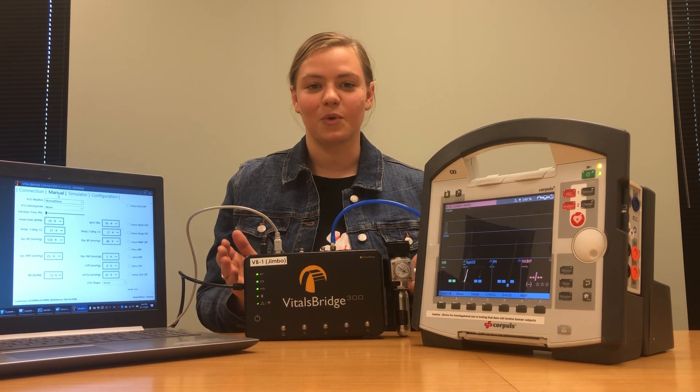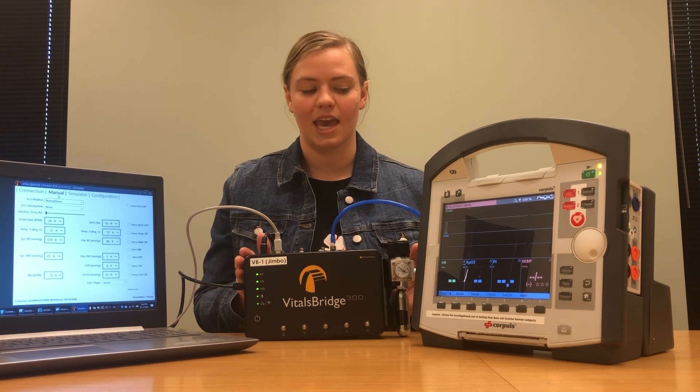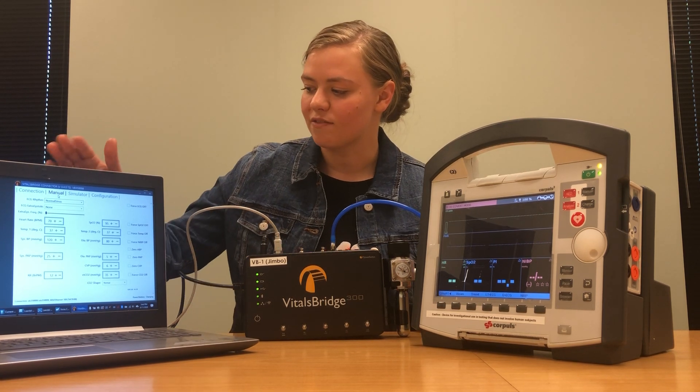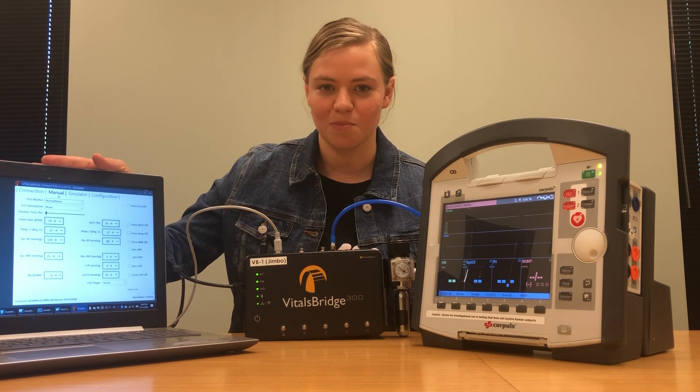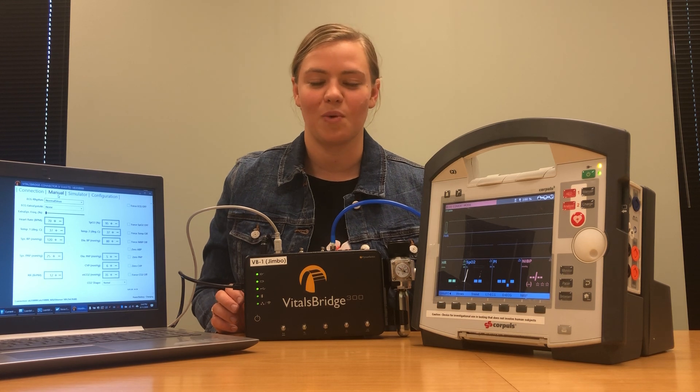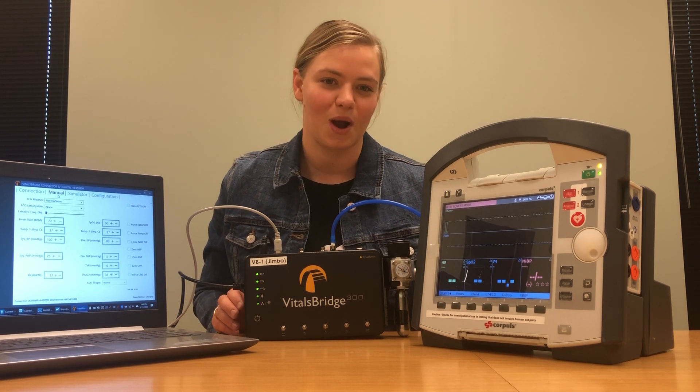Throughout this video I'm going to show you how to connect a variety of vital signs cables from your patient monitor to your VitalsBridge. I already have vital signs running on my patient monitor, which will allow us to check that all of the vital signs are working properly along the way.